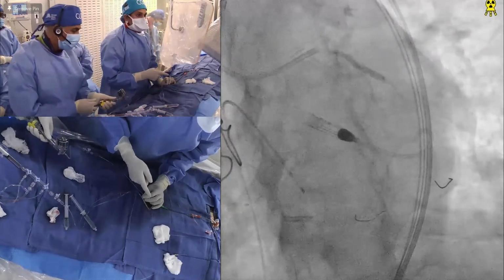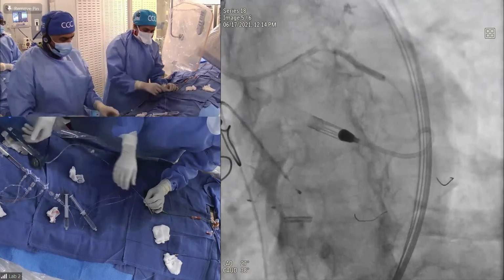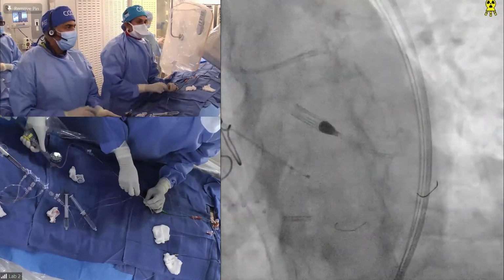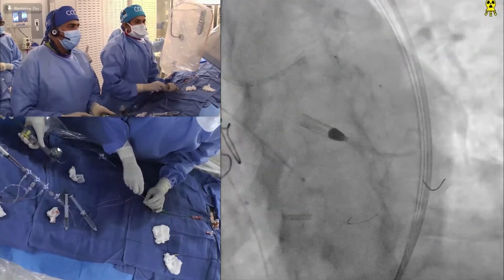Yeah, that would have been an interesting next step, but it looks like you didn't need it. Look at the balloon, it seems nice. The balloon expanded with a 1.25 burr. Yeah, it's amazing. And this is the example we say, leave the rotor wire there. So if you need to upgrade the burr, you are not worried about it.